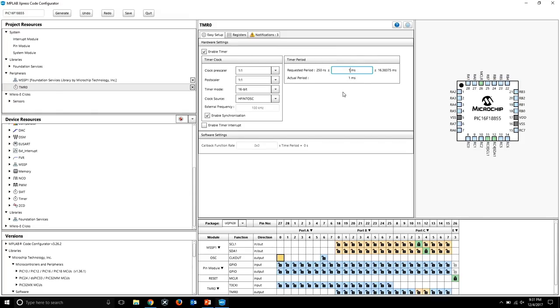Oh, I see, it made the change right below there. That's correct, yeah, all I did was type it. And obviously it's all getting calculated in the background, and all those things are taken care of.